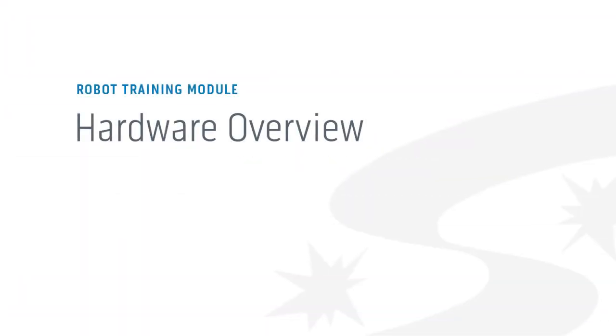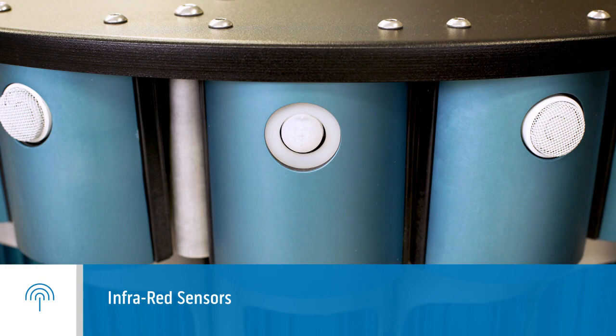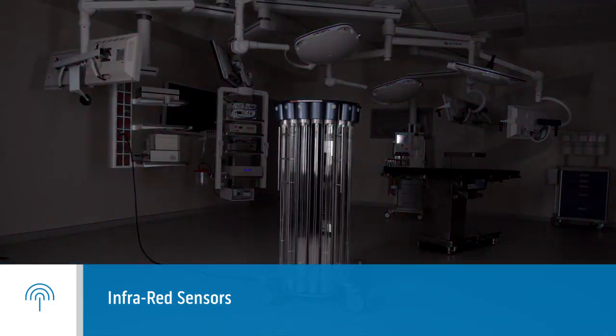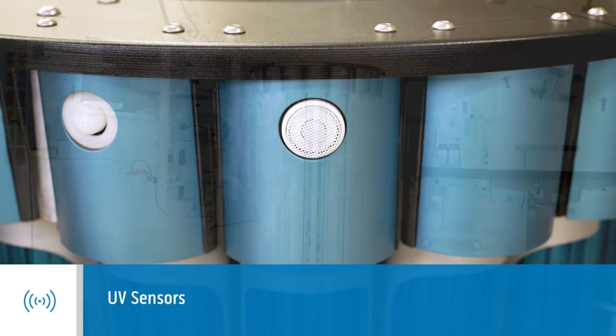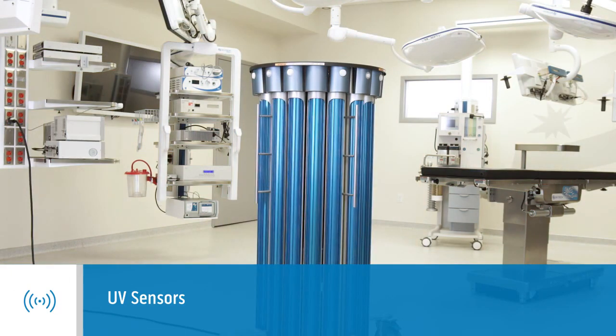Next, let's get familiar with your UVC robot's hardware, starting with sensors. Infrared motion sensors will not let a treatment start when there's motion in the room; once a treatment starts, the sensors turn off. UV sensors allow for an automated runtime, detecting when the scientifically determined endpoint known to destroy particular pathogens has been reached.